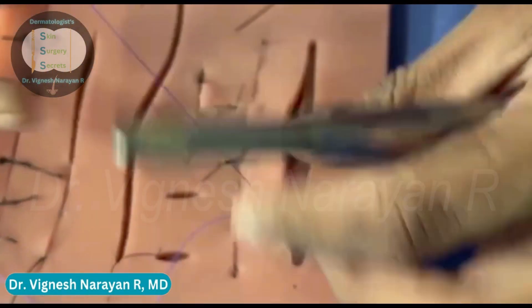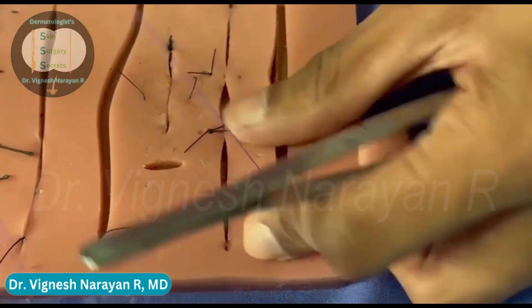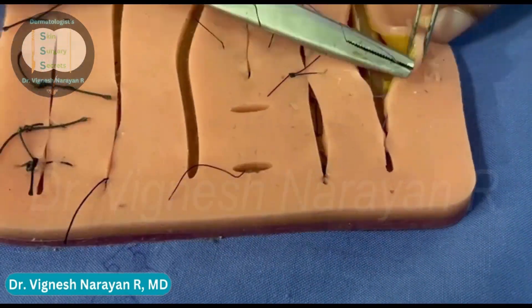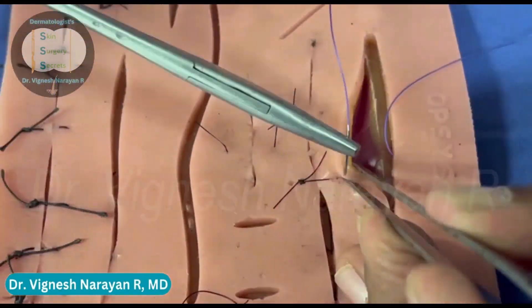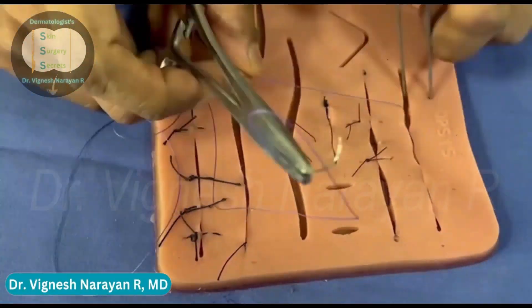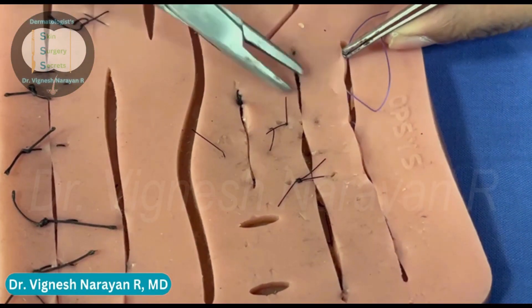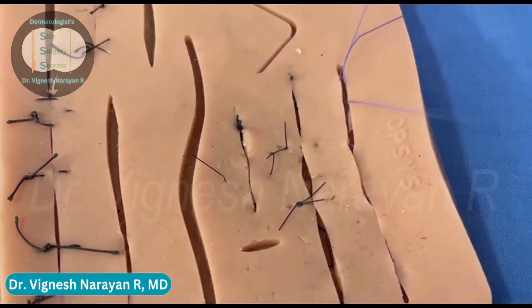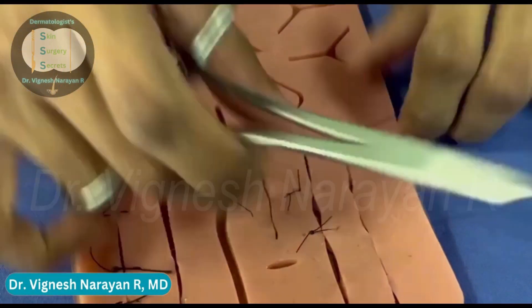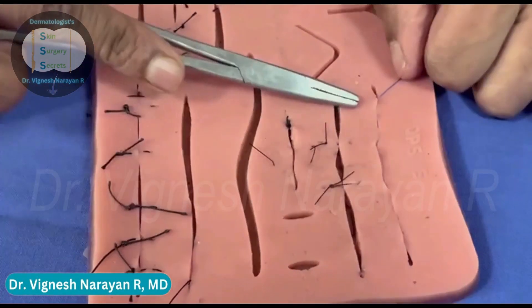Here you can see it's going parallelly through the other edge. Once you pull the suture material, you can see how beautifully the edges are approximated. You're going to do the same thing along the entire length of the wound. Once you pull, you'll have a good approximation.